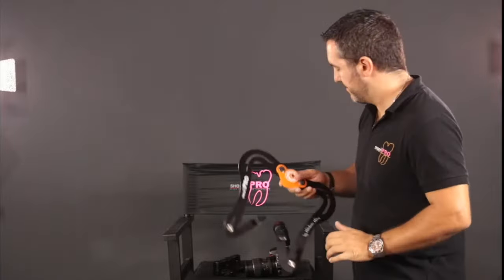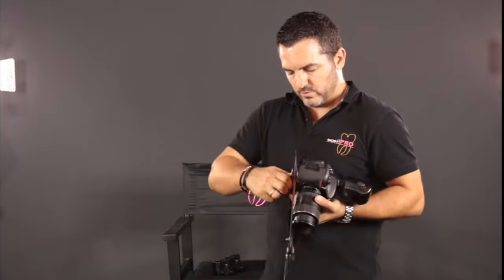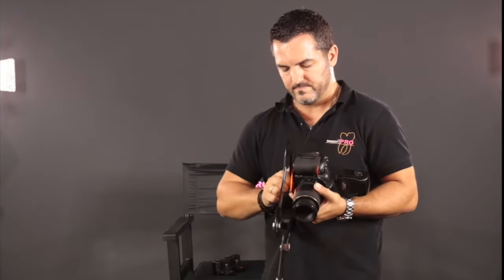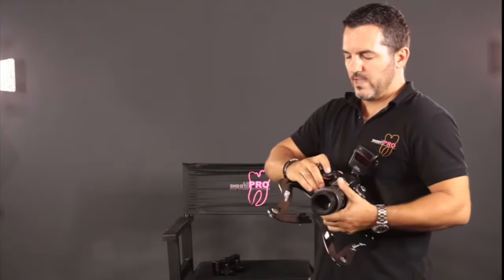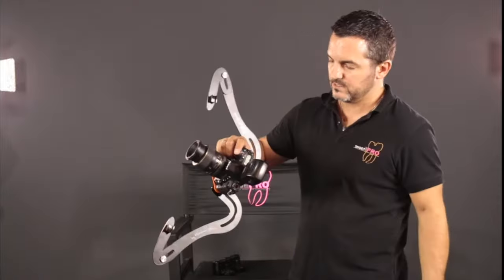And here is the Molaris. We are ready to start using it. What we have to do is just screw the Molaris onto the camera, like this. And then we are going to open it in the working position, more or less like this.